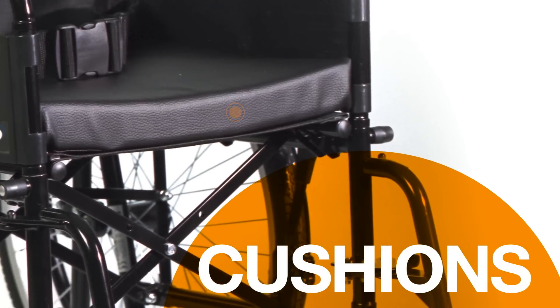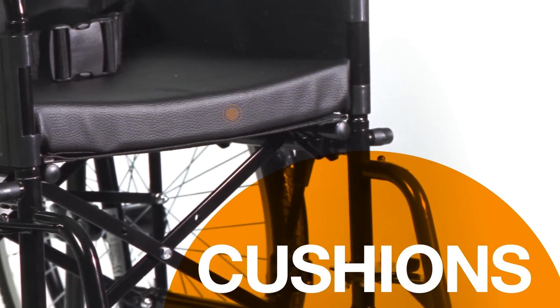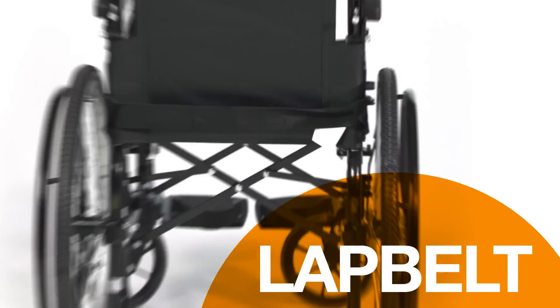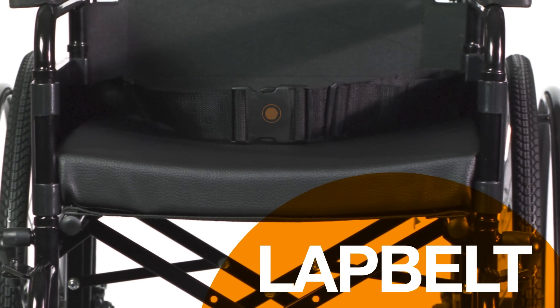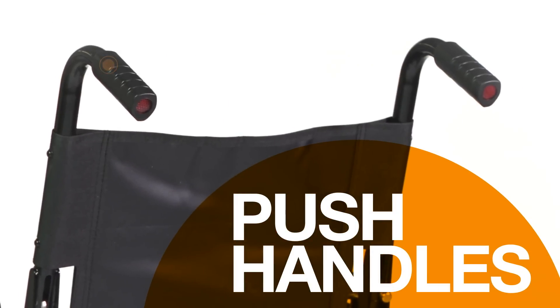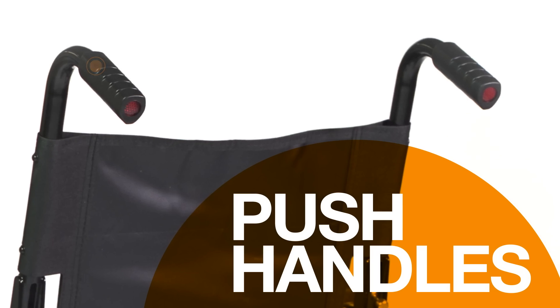Most wheelchairs have canvas seats and backrests. Cushions can be provided to give extra support and comfort. A lap belt is fitted for your safety and can be adjusted to fit you comfortably. Push handles have hand grips of moulded plastic or rubber, making it easy for a helper to operate your wheelchair.